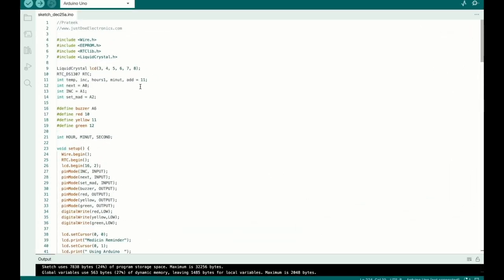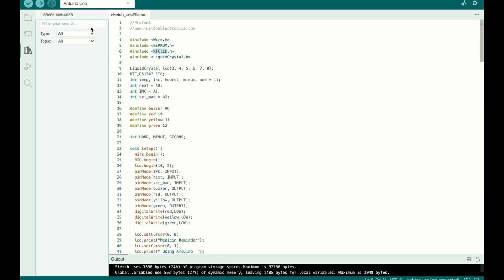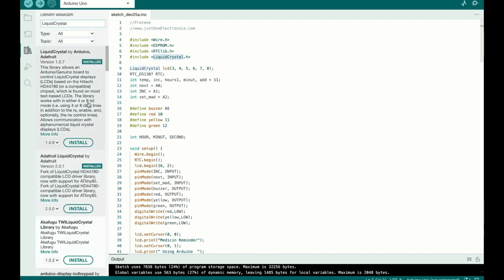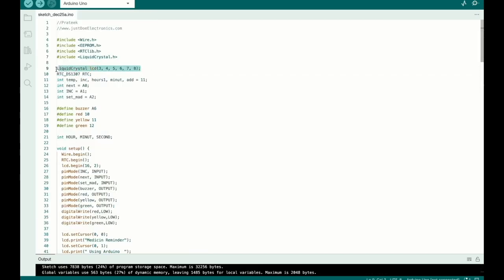Now let's look at the code. First you need to add two libraries: RTC.h and LiquidCrystal.h. Go to the Arduino library section, type 'RTC.h' and install it, then find and install 'LiquidCrystal.h'. Here are the pin connections for the LCD and push buttons.